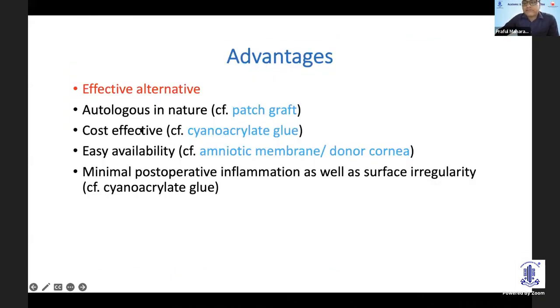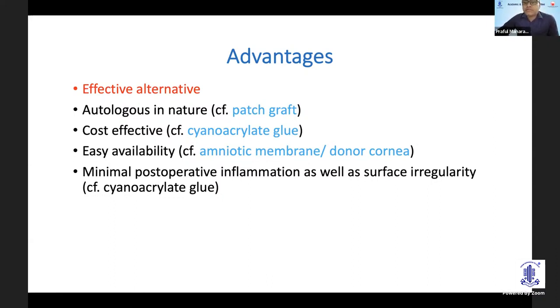Advantages: it offers an alternative especially when you don't have an eye bank setup and you don't have AMG or donor cornea. It is cost-effective — although cyanoacrylate glue costs hardly 1,000 rupees, there are still some patients who can't afford even that. And at times you are sitting in casualty at midnight, somebody comes in with a perforation and you don't have access to glue — at that time tenon's patch can help you.